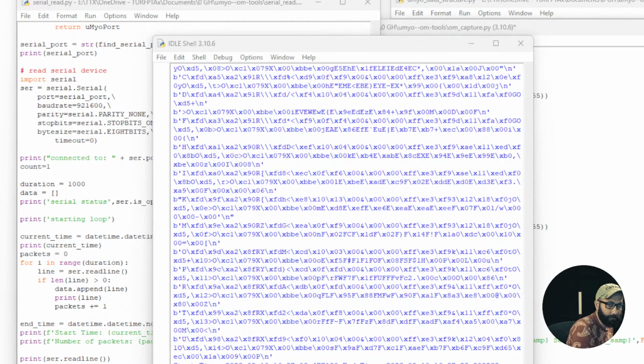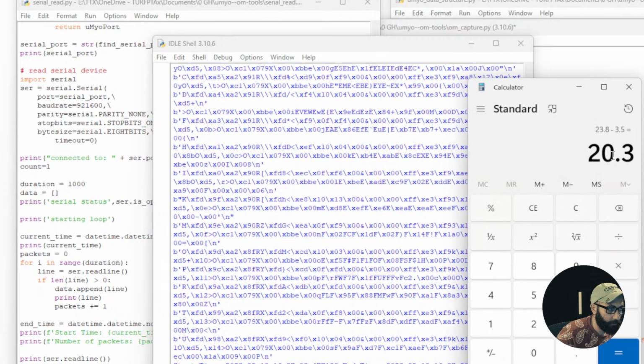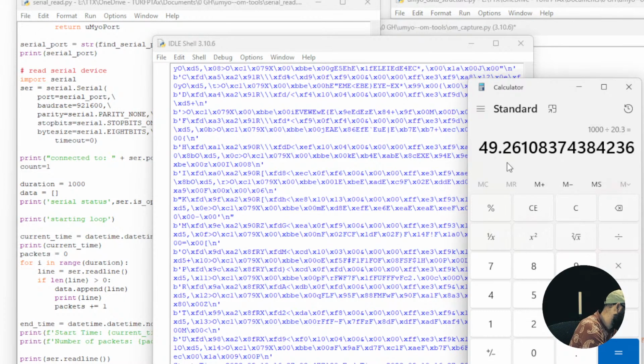So if we divide 1,000 by 20.3, we get 49 per second. So 49.261. This is actually awesome. This is really good because of the number of packets that are coming in. I might have slowed it down again by accident by putting these to the screen, but it gets about 50 packets a second.